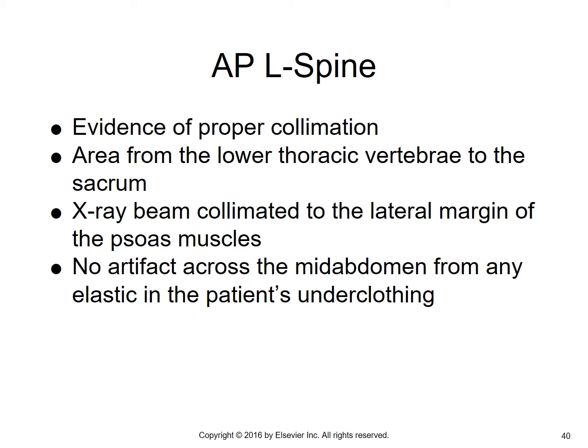It's going to depend on the site that you're at. At some sites, some places have the patients remove their underwear. Of course, they have a hospital gown on. Other places, they have them leave the underwear on. So it's really up to the site that you're at.